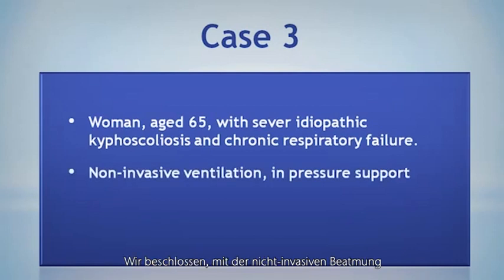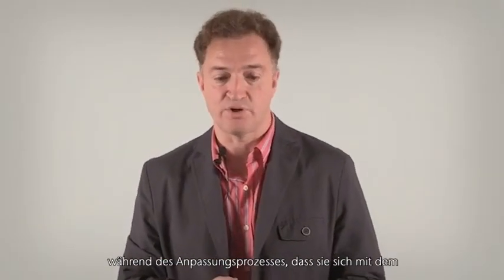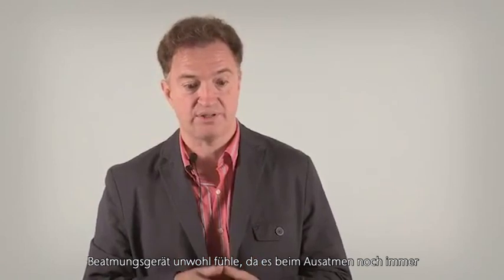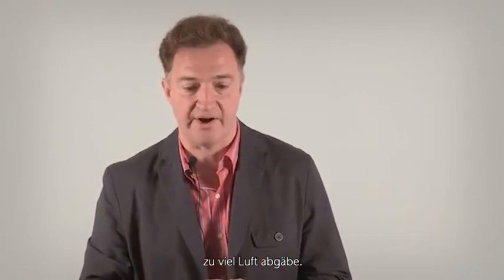We decided to start with non-invasive ventilation in pressure support mode, and the patient having a severe restrictive disorder, we decided to set a minimum inspiratory time of 1.2 seconds. During the adaptation process, the patient complained that she felt uncomfortable with the ventilator because when she was trying to exhale, the ventilator still gave too much air.